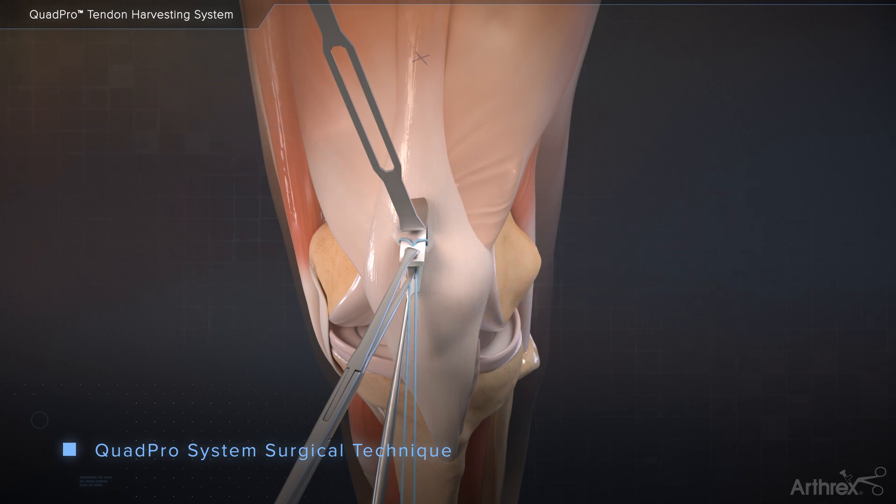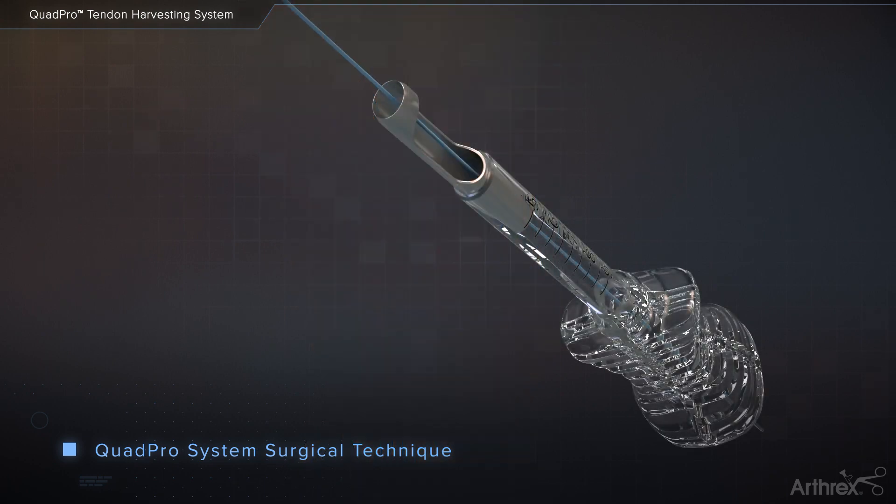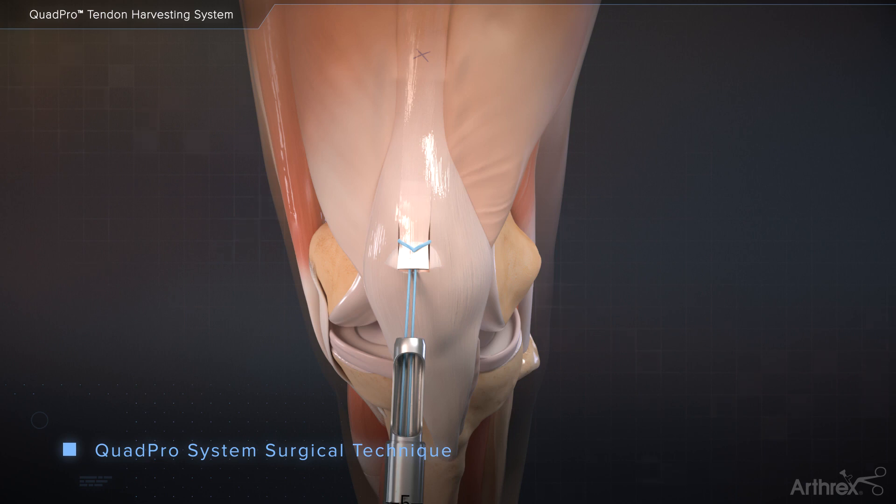Use a fiber loop suture to place a tagging suture 1 cm from the end of the graft. This suture is used to maintain tension on the graft during tendon harvesting. The weight of the needle can be used to shuttle the tagging sutures through the cannulation of the QuadPro Tendon Harvester. Alternatively, a lasso wire can be used for shuttling the tagging suture.